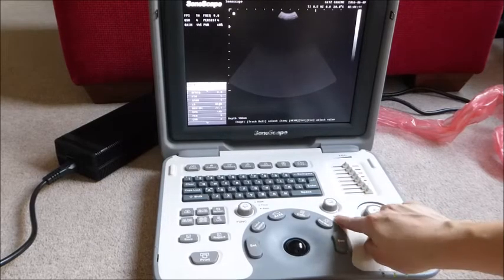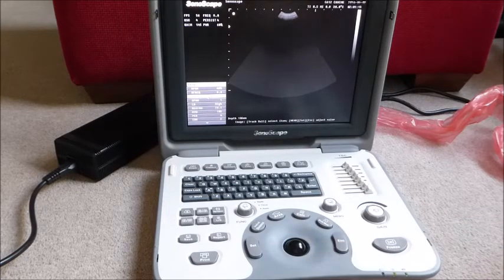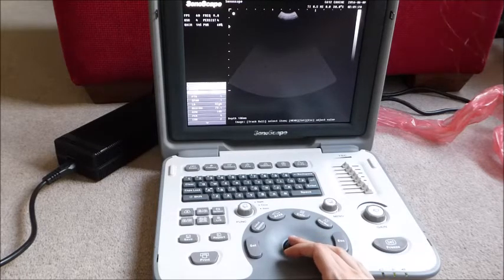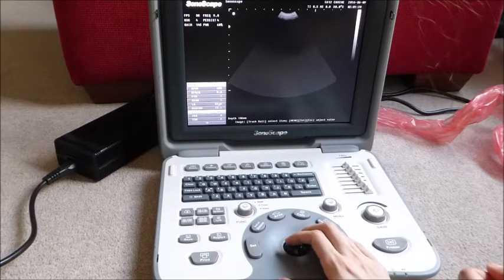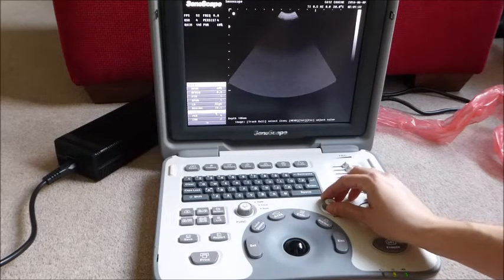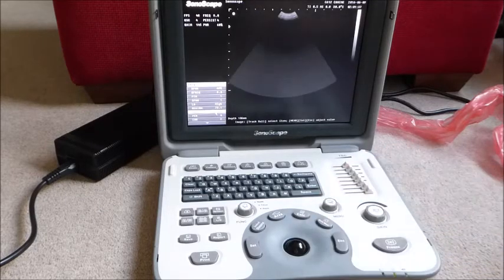If you click this menu button, this brings up a number of other factors. I don't have my contact lenses in, so I'm going to get closer here. Okay, frequency is the same, we've just gone through it. You can control it on the menu if you want, but you've got your shortcut here. Dynamic range, you may want to change that. Basically, if I bring it down, let me get my liver back, hold on.